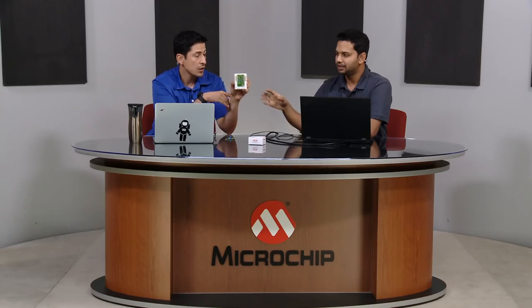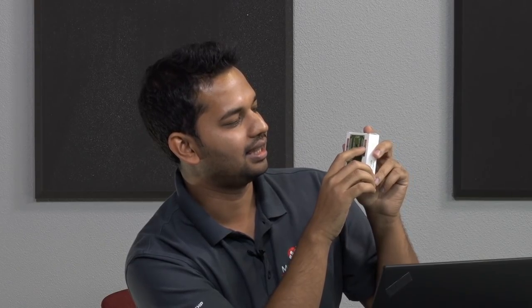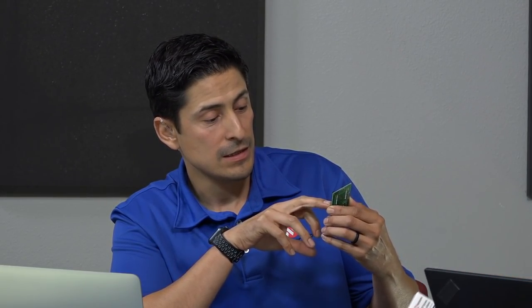Okay, and if you look at the board, I'm just going to show the board here. You can see the SCL, although it's probably very hard to see. Yeah, you can't even see it, but I'm telling you guys, it is there once you get a board. So there's a data and a clock line, and it's actually RC3 and RC4. RC4 is written on the board as well, and you can see it from there. That's what's being used for communication, the two lines, data and clock, right above the 5-volt.